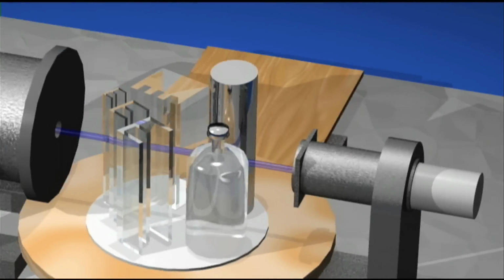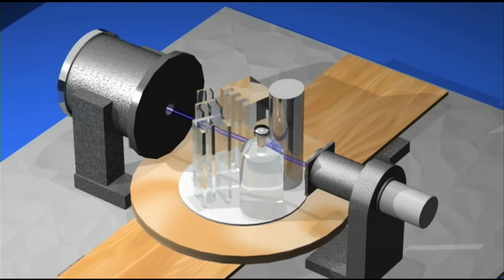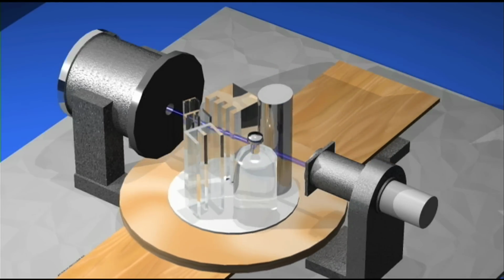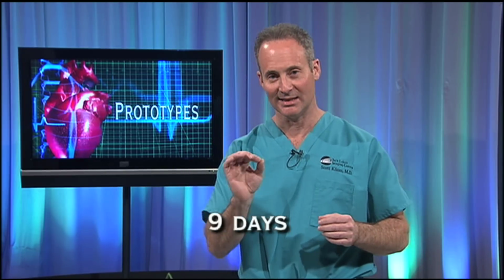And these objects would pass through that pencil beam detector, and once they passed all the way through, it would rotate 1 degree and pass through again. And it would continue to do this until you got 180 degrees around and completely imaged that entire object. This prototype had to operate 9 days continuously to acquire a single image because it was a low-level source of radiation and the technique for acquiring it hadn't really been established. 9 days continuously. So you think holding your breath for a couple of seconds is tough now. Can you imagine holding it for 9 days?